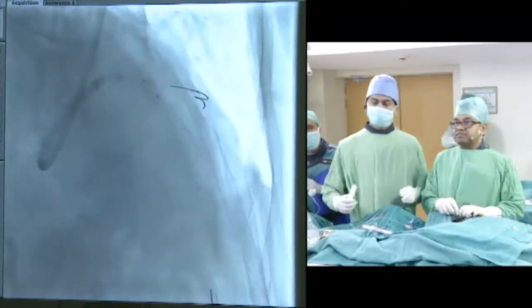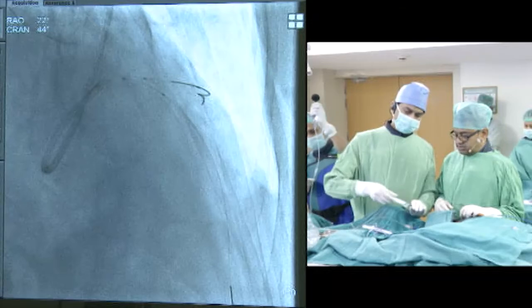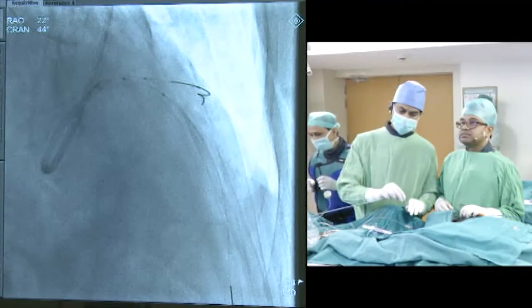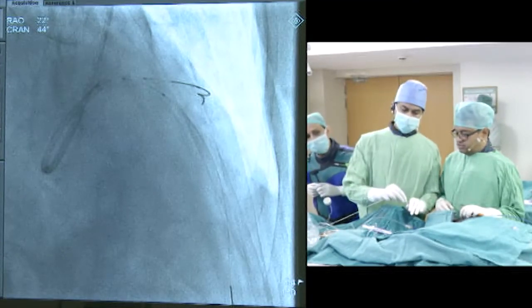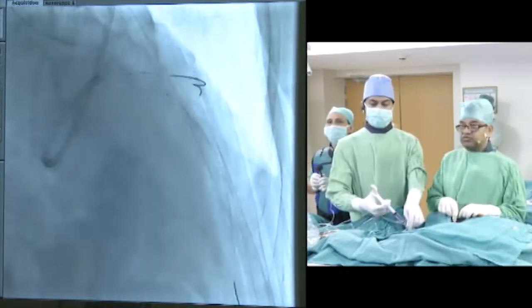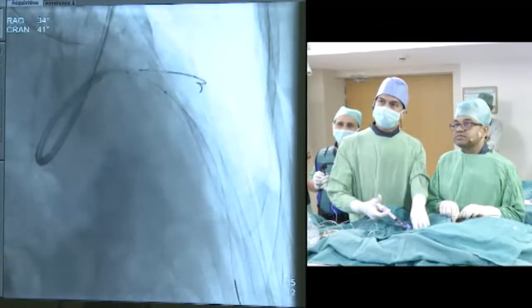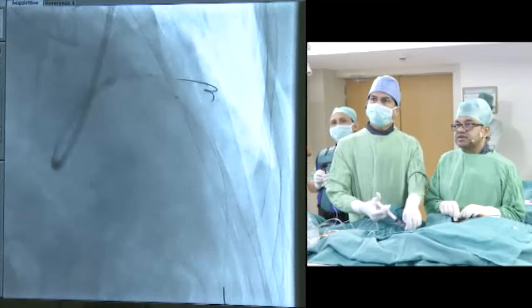So you place the NC balloon across the diagonal ostium just to make sure that nothing pops in. Can we have a check shot now? Connect, please. Who is on the stent? Stop. So we'll come a shade inside the diagonal. I think this looks good, because remember there is 5 millimeter extra scaffold beyond the marker. So we'll take a final shot.